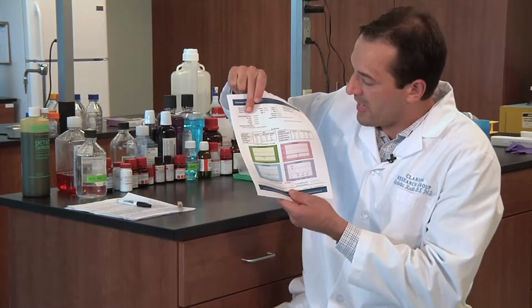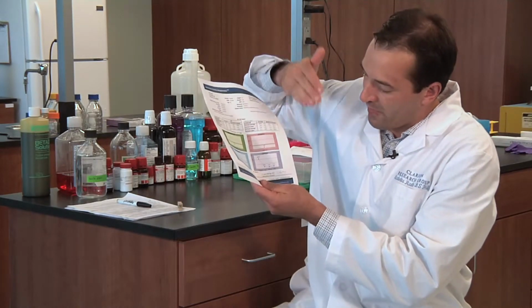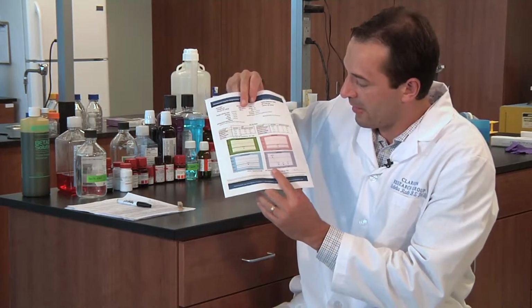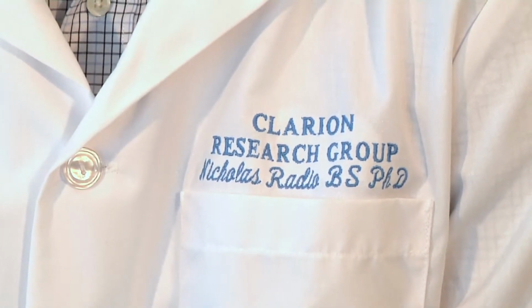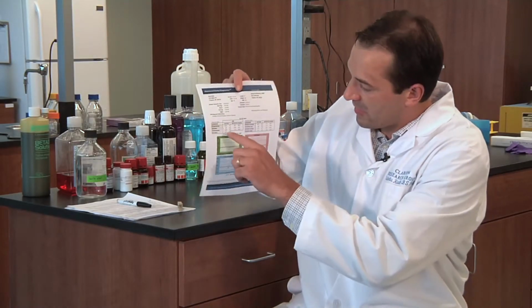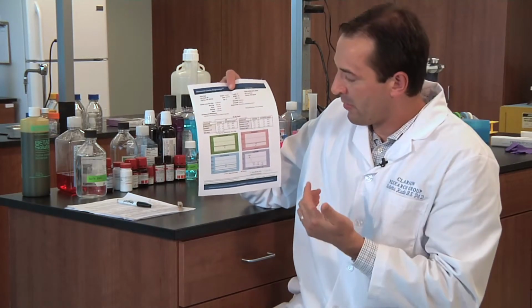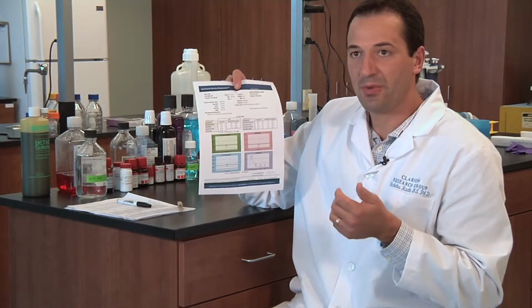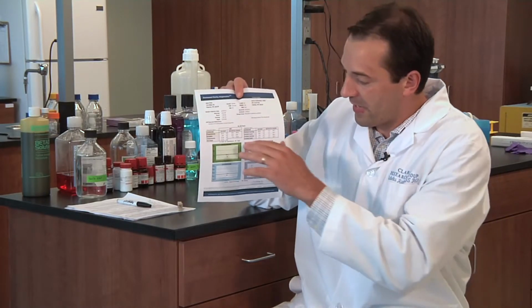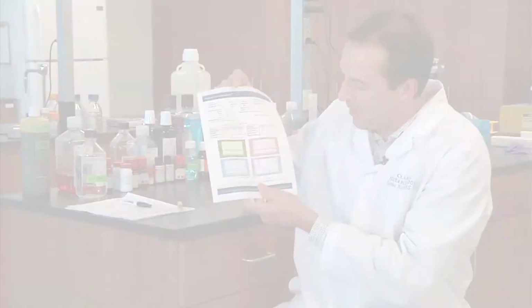We also have on it the time that it was collected and the different time points, because you'll notice for hormones like the cortisol, again, we're evaluating it across 4 separate time points because of that diurnal release that you'll find with cortisol throughout the day. The actual values are shown both quantitatively as well as in graph form. And what you'll see is that the patient's values are listed, and then we have a reported range just to the right of that. That reported range is apparently healthy individuals. These are individuals that pass a series of criteria so that we can say that in this population range, this is how your values would compare to somebody in that range that is not reporting any symptoms.